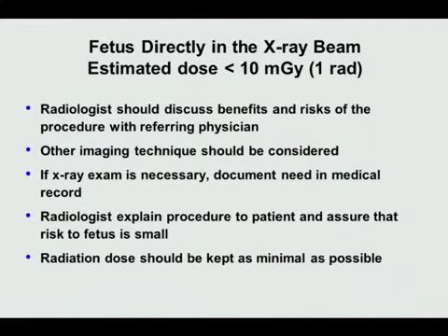Here are some tips which can be followed for a fetus directly in the X-ray beam, where the estimated X-ray dose is less than 10 milligray, such as in radiography or fluoroscopy. These are recommendations we discuss with our residents and physicians. Radiologists should discuss the benefits and risks of the procedure with the referring physician, and as with any X-ray procedure, other imaging techniques should be considered if possible.